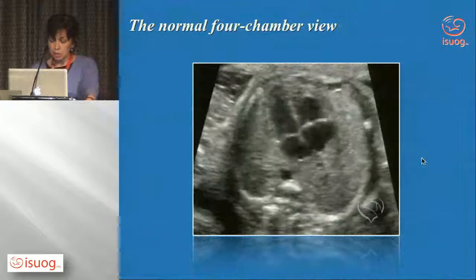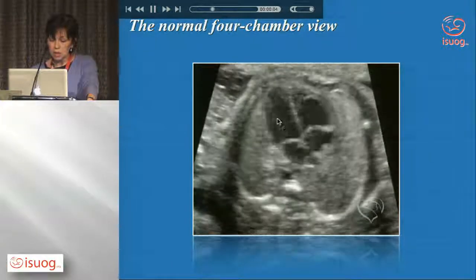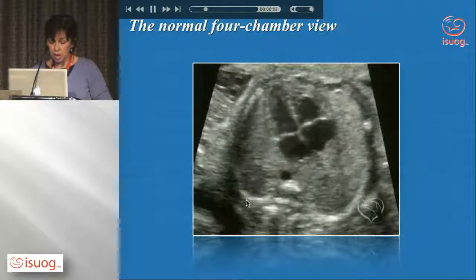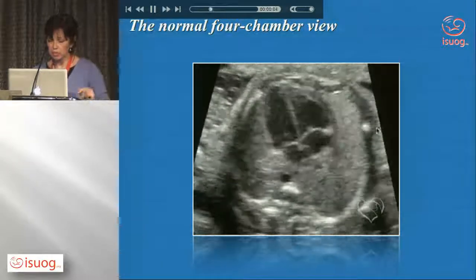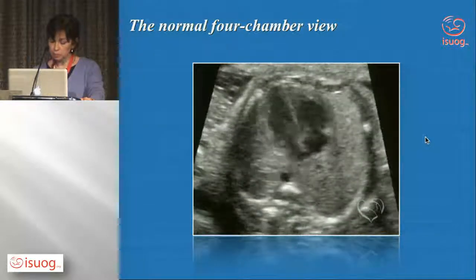It's the same as the clip. So good contractility, the heart squeezes everything in systole and opens in diastole. There is symmetry, right and left more or less the same size, two valves opening and closing. And remember that you do need to see those valves opening and closing separately. Very important for the assessment of atrioventricular septal defect.